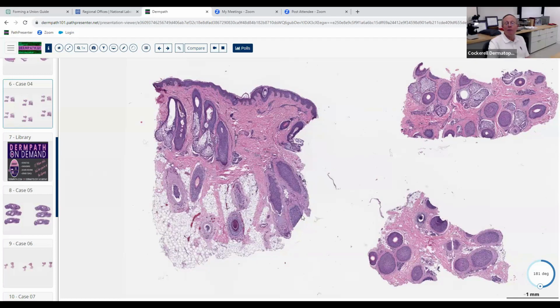In what stage are the hairs right here? So you're right. Normally, if I biopsied your scalp, we'd see about 8 to 10 wonderful anagen follicles living down near the subcutaneous fat, 8 to 10 on a horizontal section, just like this. What about here? Do we see that many? We see a lot of hair follicles in here, but are they all in anagen? They're all in different phases. Good. They are in all different phases.